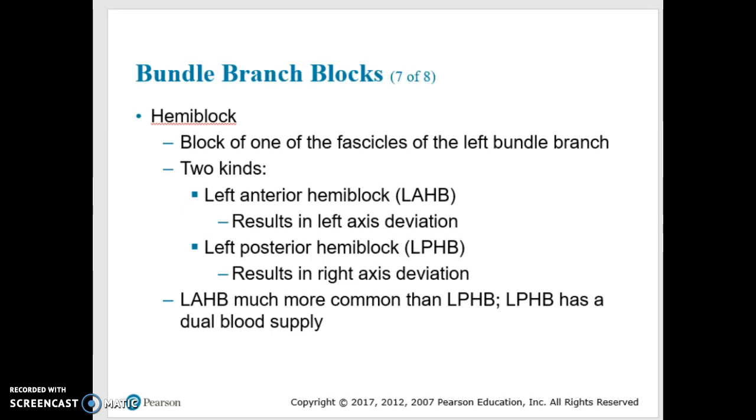But please take note of this slide right here, because you will need to know this portion. You'll need to know that if you have a left axis deviation, that would indicate an LAHB, and a right axis deviation would indicate an LPHB. So we can put that into context when we're working out the strips together. But for now, plant this in your memory. And I will be in touch with you, and we'll work out some strips together in class.